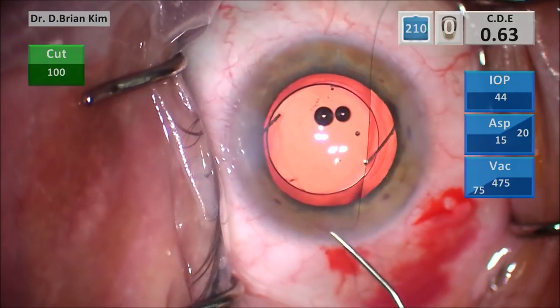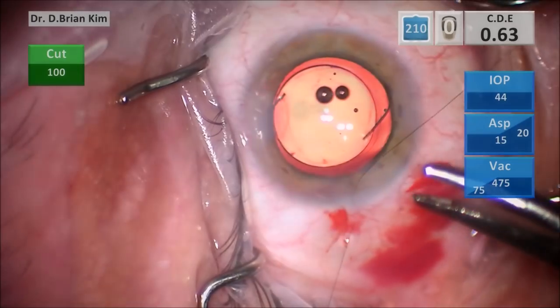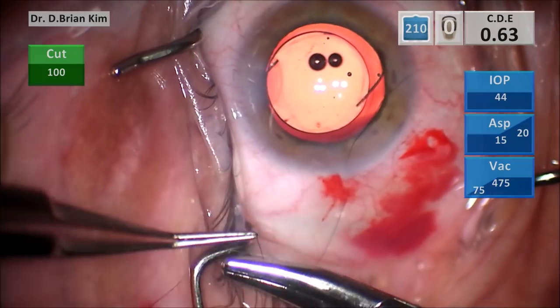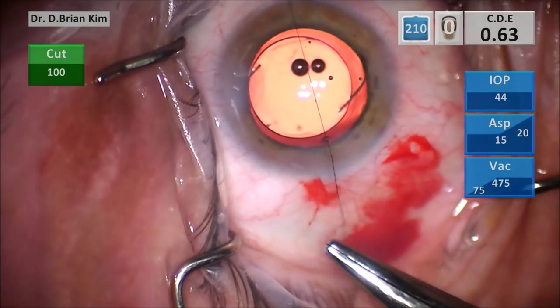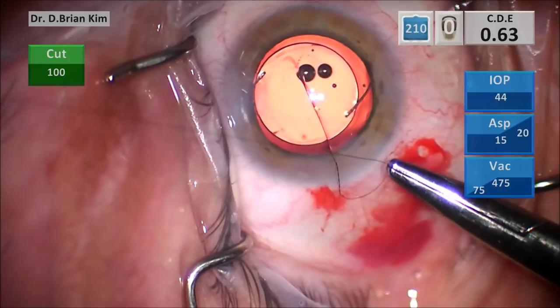At this point, I could have put in some Miochol or Miostat to constrict the pupil. I could have put in triamcinolone to stain if there's any vitreous. But I felt very confident that there was no vitreous in the anterior chamber at this point, but certainly it doesn't hurt to do that.